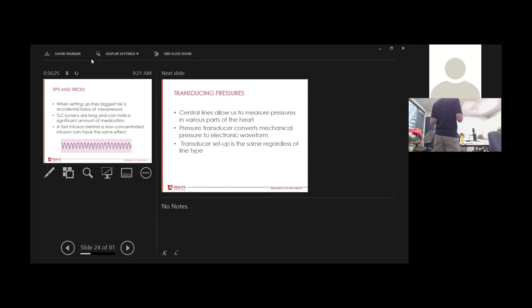But if you bring in an amio drip going 40 cc's an hour, you're going to push a negligible amount. You're going to take your amio, which is going at 40 cc's an hour, and give it now at, say, 42 cc's an hour, effectively. That's not a big deal. When you're lining pressors together, it's the same thing.